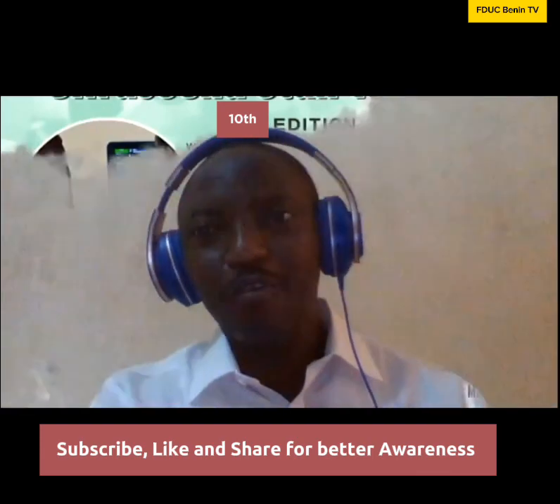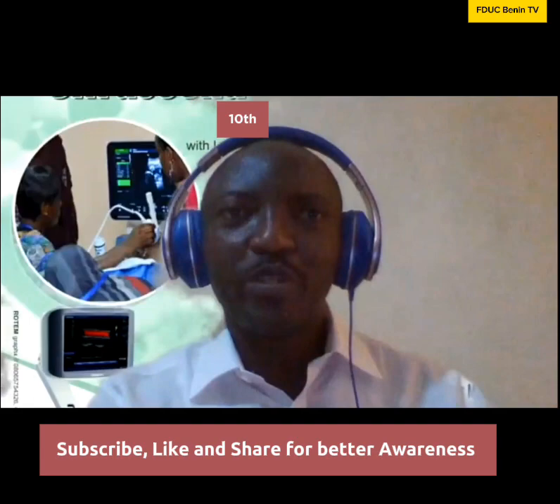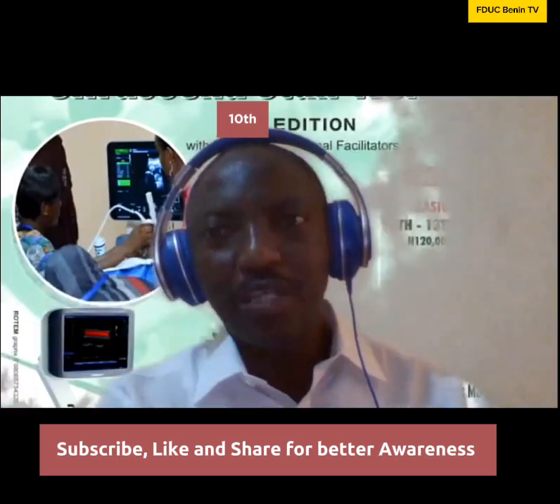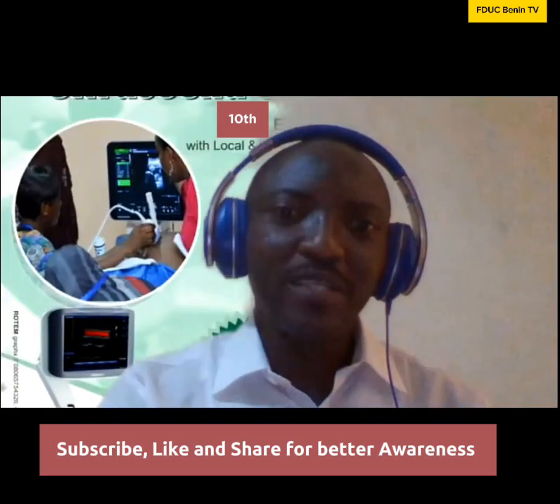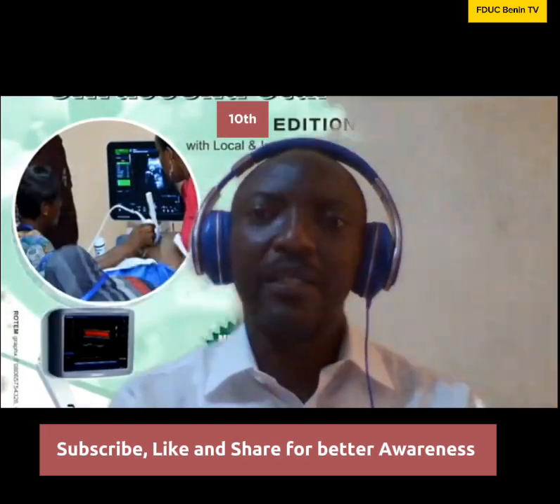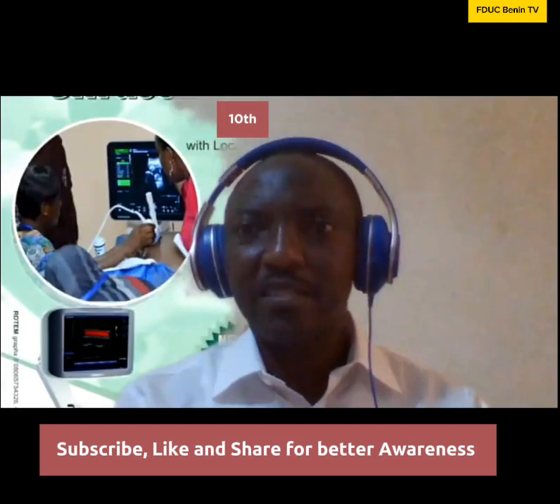I have been in Dopplers for a while now, but I still picked up a lot, especially on what you do with the PRF and how you adjust gain, so that once it's getting beyond the vessel, you start moving in the opposite direction. Usually, I don't cram whether you increase or decrease. You scroll to one side, you find that it's going beyond what you expect, then you scroll to the other side. So all these are things that we'll pick up and learn along the way, and we all will continue to get better.